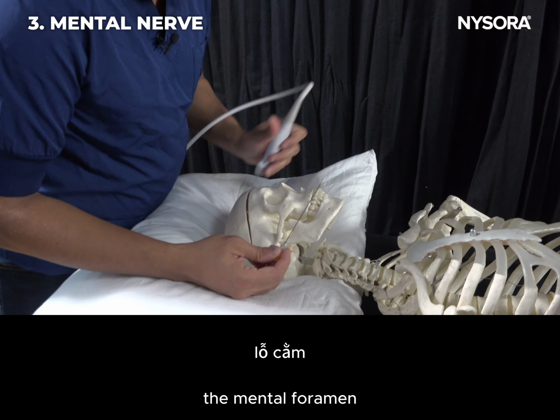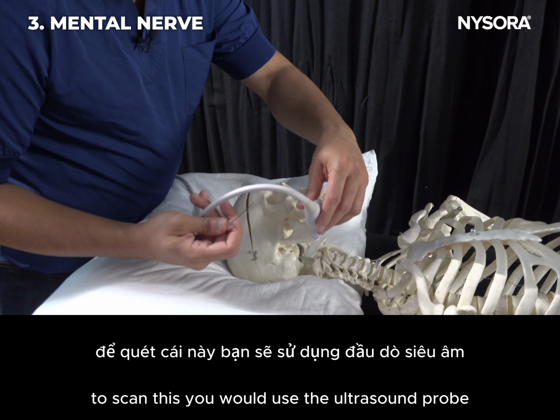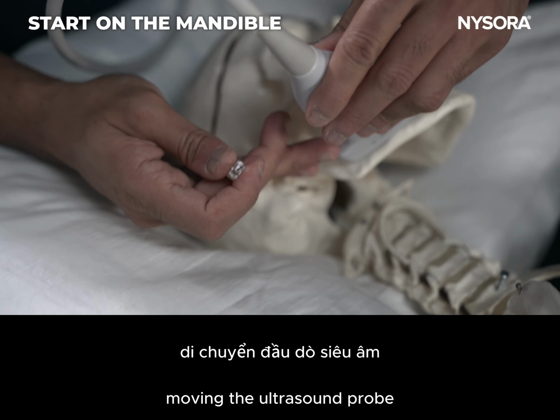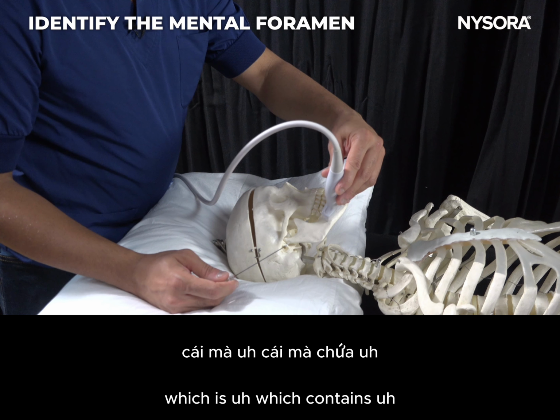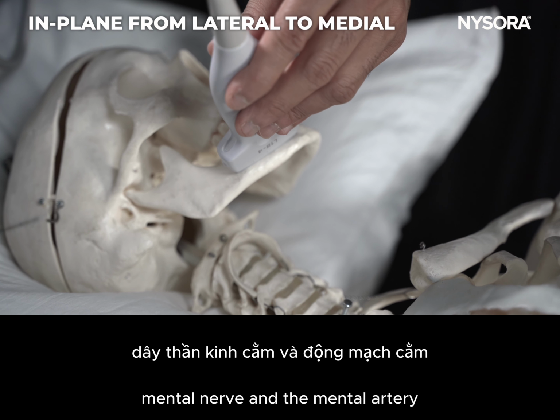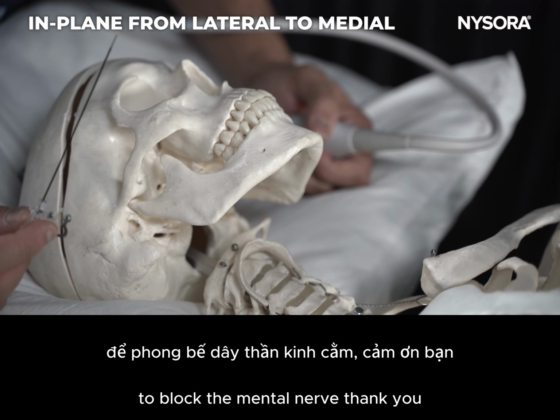The mental foramen, to scan this, you would use the ultrasound probe and place it on the mandible, moving the ultrasound probe more cephalad and more medially, looking for the mental foramen, which contains the mental nerve and the mental artery, and you will be able to use an in-plane technique to block the mental nerve.